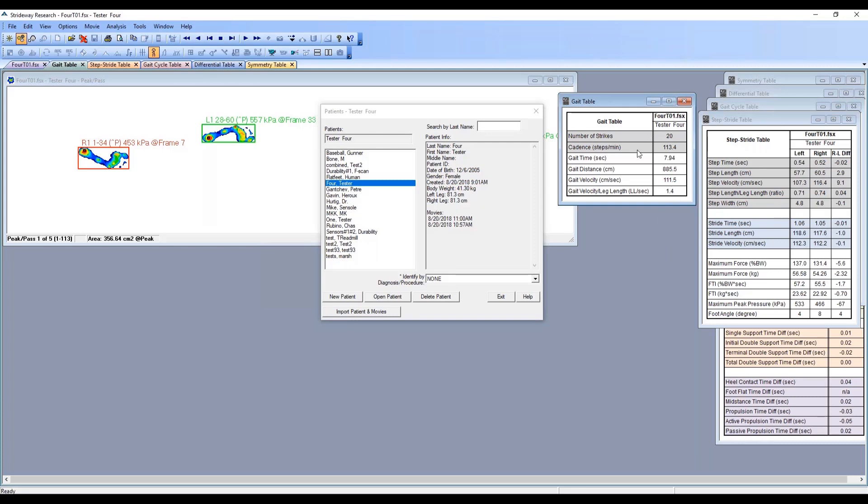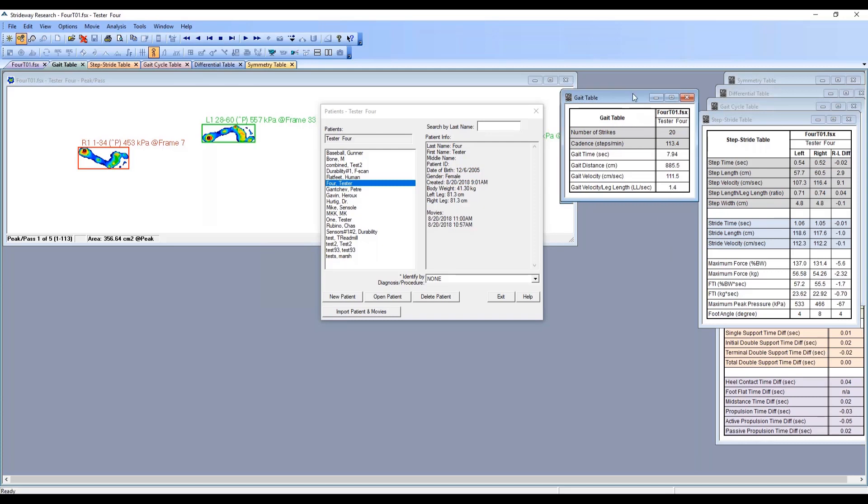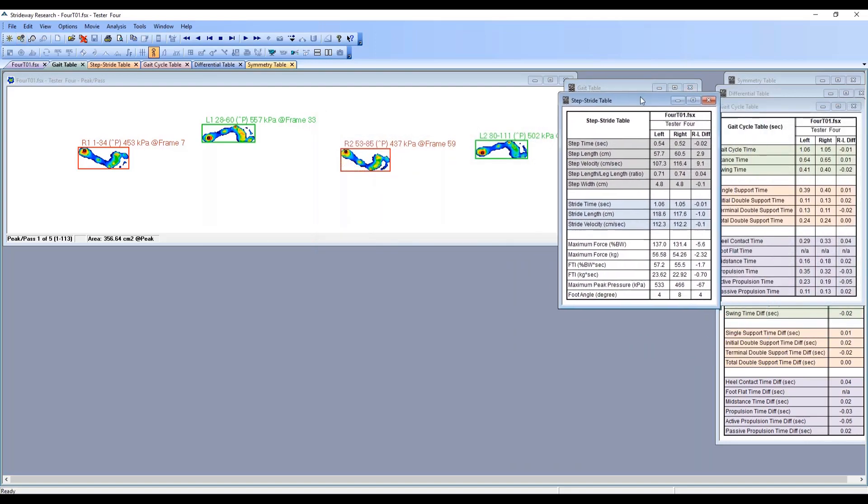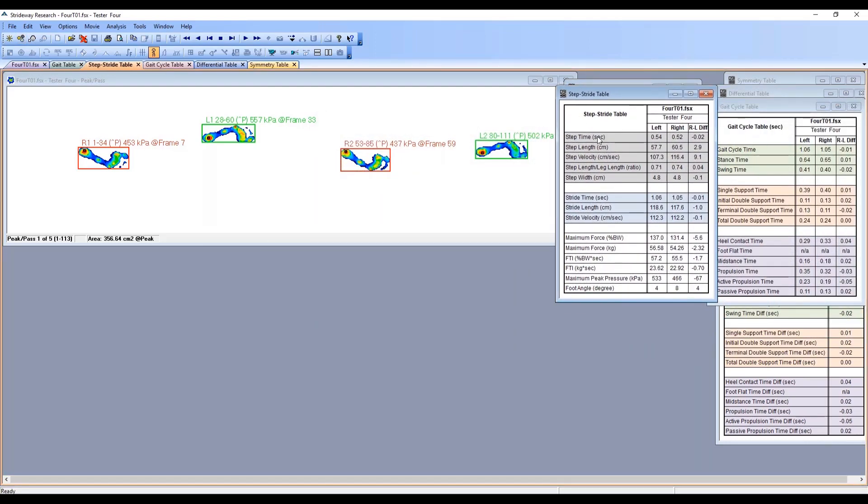Our step stride table shows step time, step length, step velocity. Everything is averaged for the left foot and averaged for the right foot, and then this is the difference between the right versus the left. It's a positive difference because the right side is larger than the left. The RL difference calculation is always right side versus the left.